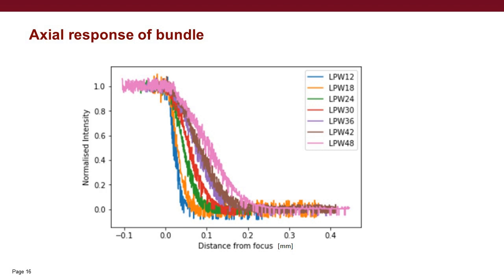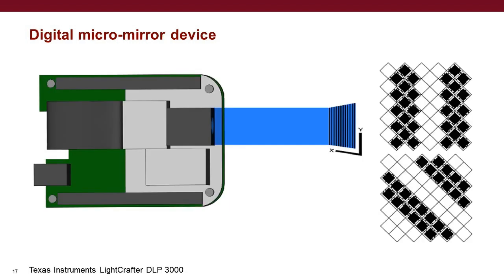So like I said, the device we use to generate the lines looks like this, and what I'm really showing here is how you optimize these patterns. It depends on the pixel structure of the device. This DMD that we used here, the DLP 3000, has a diamond pixel array, so what you need to do is orient your line pairs at 45 degrees, and that way you don't have any artifacts near the edges.